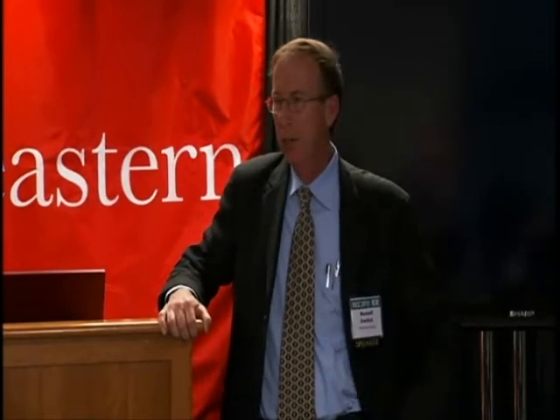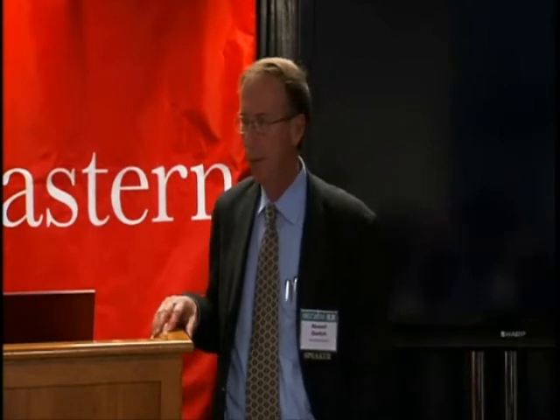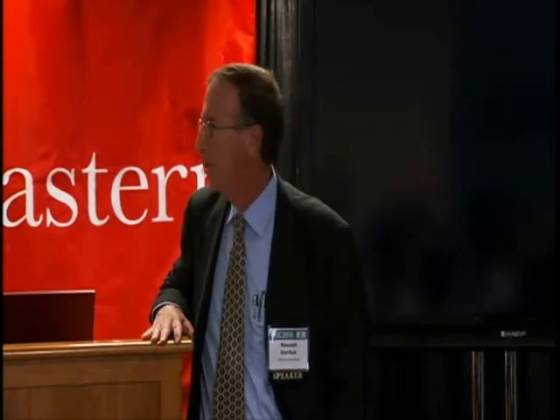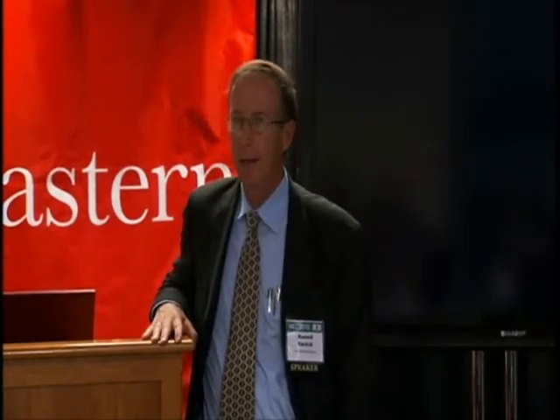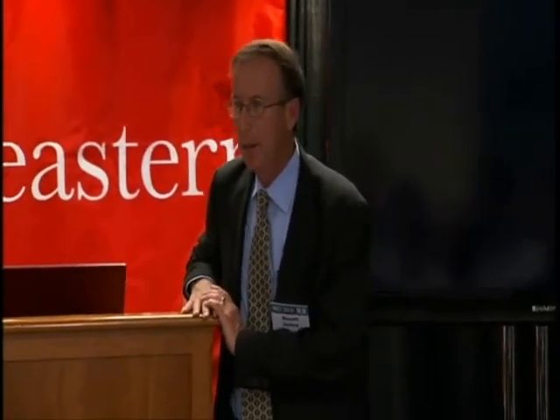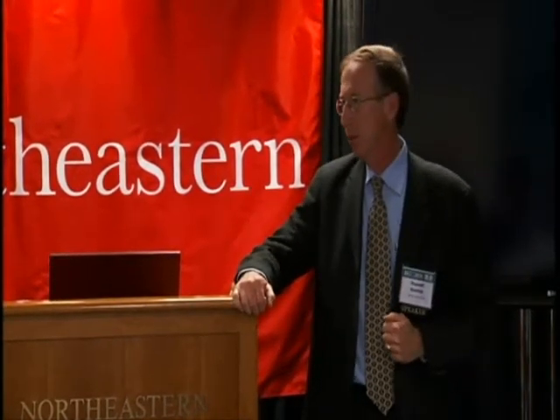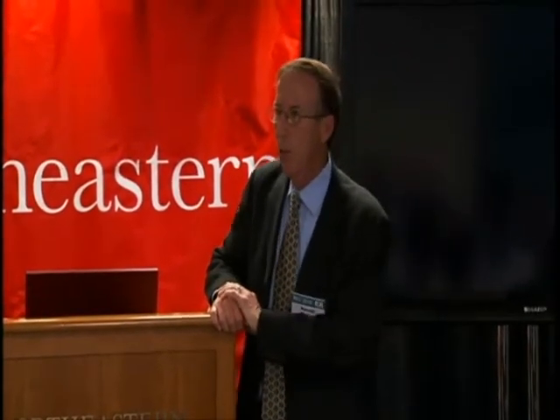Roger just showed us some data measuring estradiol at ultra-sensitive levels. But back in the day, we'd do it with radioactivity in antibodies. And there's a revolution going on, a very slow one, by the way, of moving away from antibodies to mass spectrometry. Think about it: the assays that are done by antibodies today number in the hundreds of millions per year, and it adds up to billions of dollars of revenue.